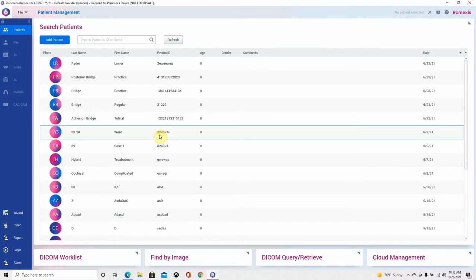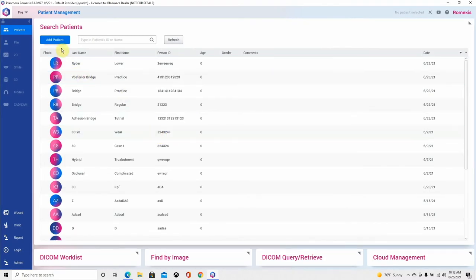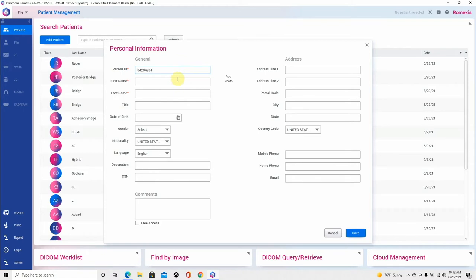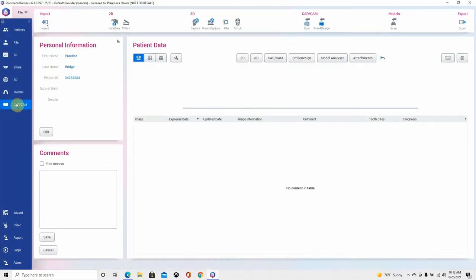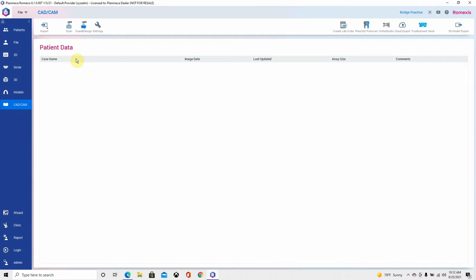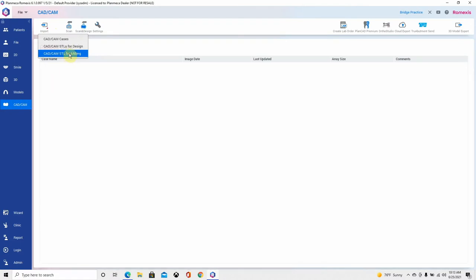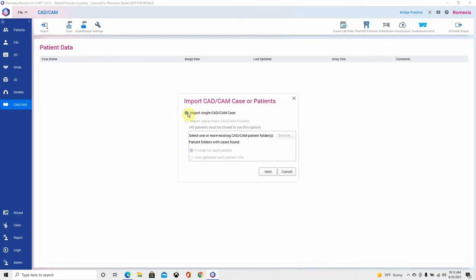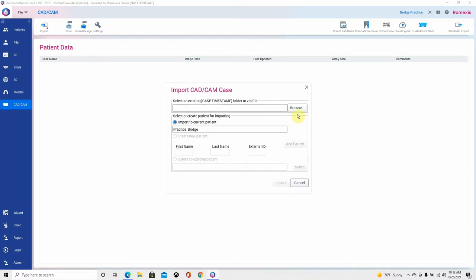Go ahead and open Romexis. Let's add a patient here — I'm going to call this 'practice bridge.' Then let's go to the CAD CAM module and we're going to import the zip folder that you should have already downloaded. The way that we do this is we hit the import icon in the CAD CAM module.